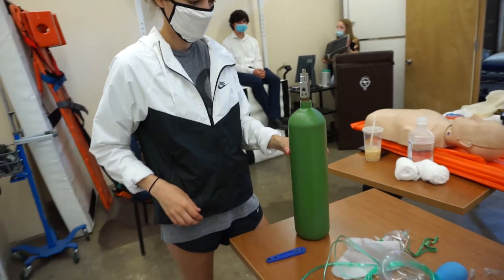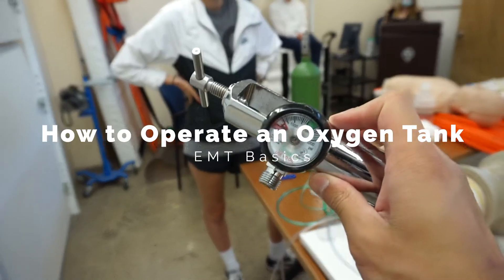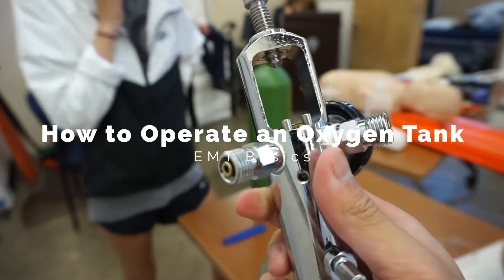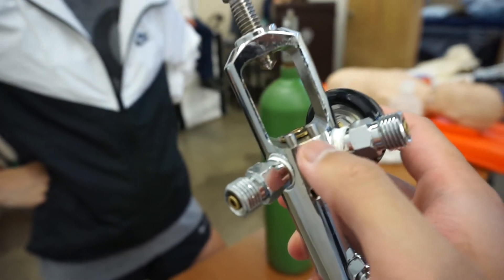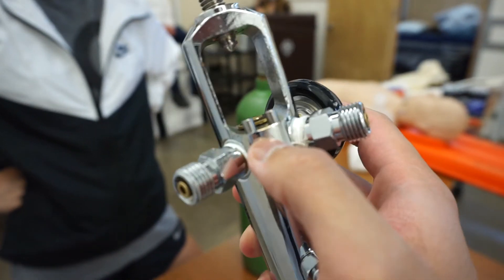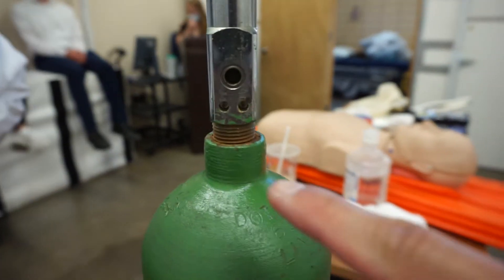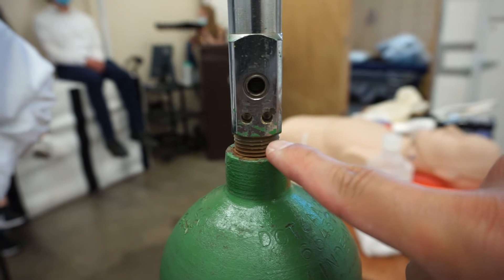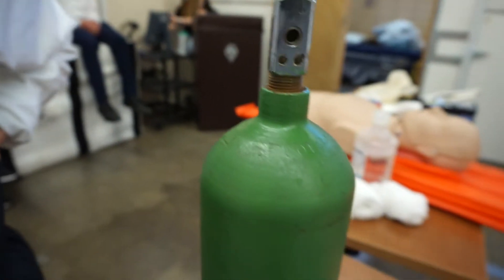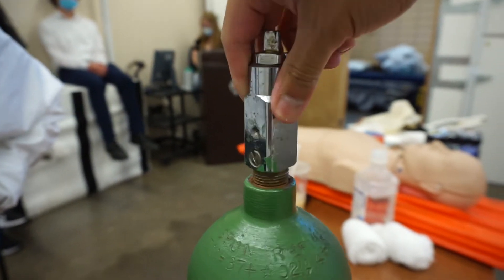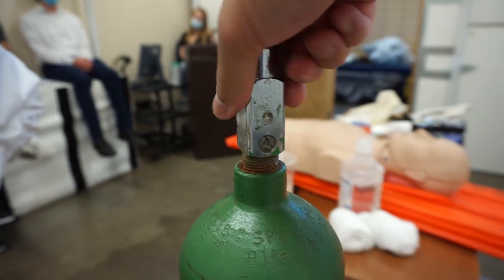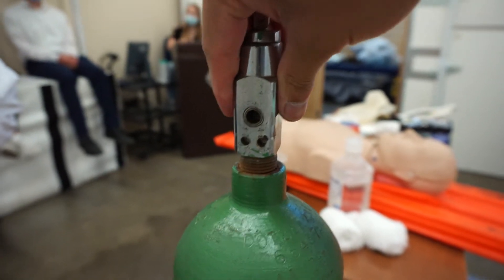Alright, so in this next skill we're going to learn how to apply a regulator to an O2 tank. What I want you guys to keep in mind is these two notches right here coming out of the regulator. I call them teeth and I want you to place the teeth inside of these two holes or gums. There's really only one way to apply it if you look all the way around the tank. No other side is going to have these two holes.